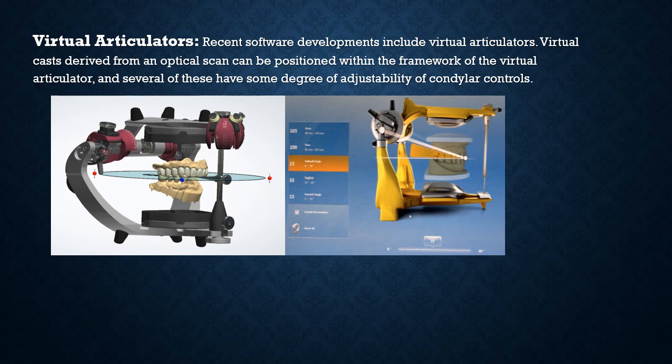Well, in spite of these advancements, there is, as I say, some limitation of these virtual articulators, as they are costly and they require digital scanners, digital sensors, and a good knowledge of the software and knowledge about the CAD-CAM technology.